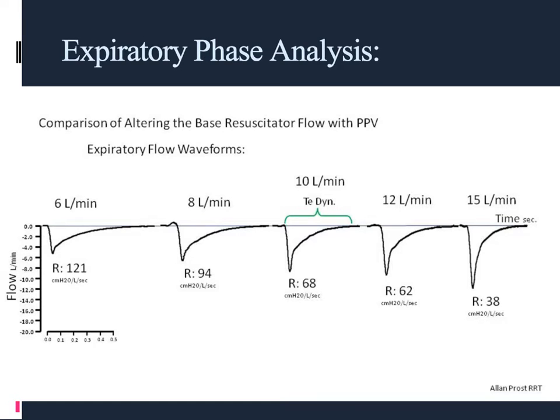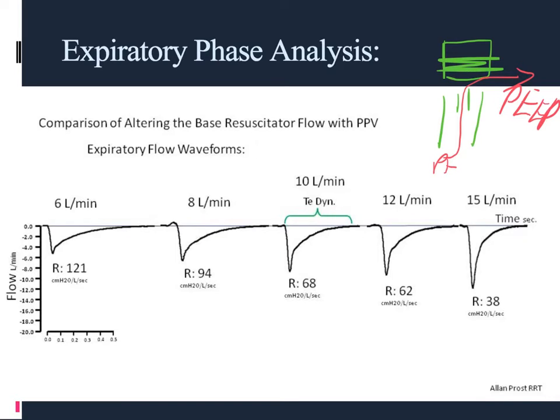Now, the original purpose of our study was to look at the expiratory phase of the NeoPuff and breath delivery, and the effects of using a flow restrictor to create PEEP, and that's what the NeoPuff does. We have a set device here with a little cap that goes on the top like this, and a little hole that goes through here. So the flow coming back through the NeoPuff from the patient, this is how the PEEP is created, by creating this bit of background resistance.